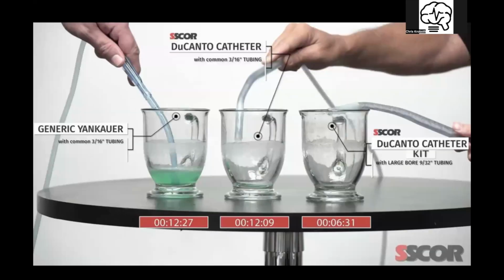This is an example of the generic Yankauer on common 3/16 tubing, the Ducanto catheter with the normal 3/16 tubing, and the Ducanto catheter with the large bore 9/32 tubing. The difference it took to clear out the contents of this cup. So at 12:27, the Yankauer was still pulling. At 12:09, the Ducanto with the regular 3/16 tubing had it all out. At 6:31, that's seconds, by the way, the Ducanto catheter with the large tubing had cleared the cup. So half the time of the Ducanto with the 3/16.